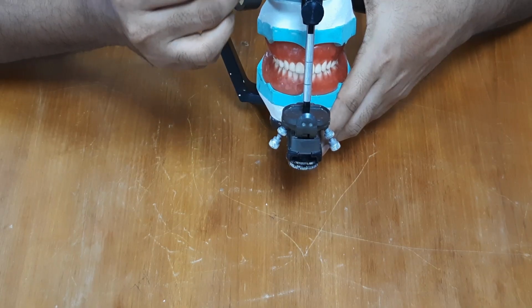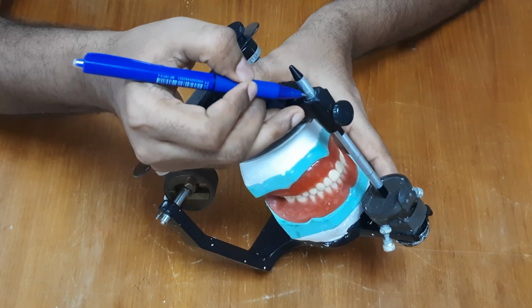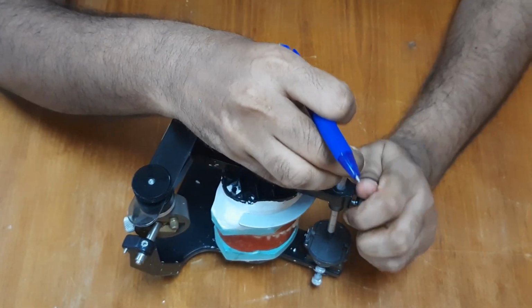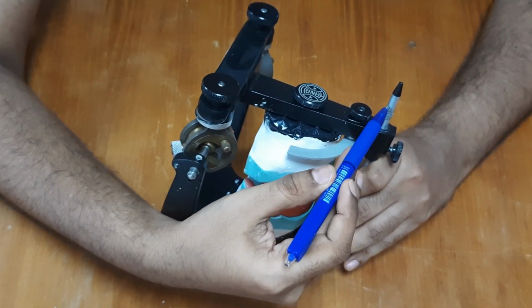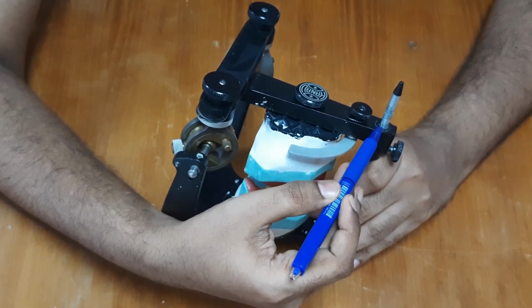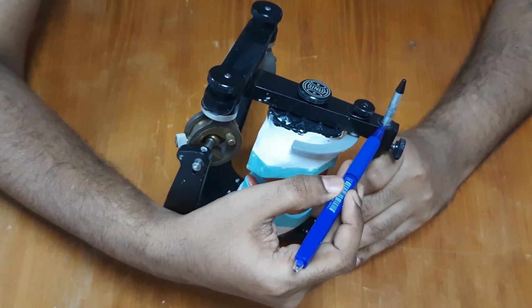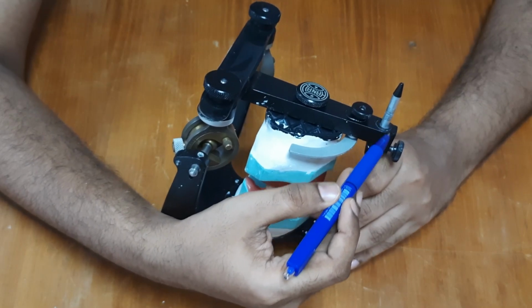There is a set of closely spaced markings on the upper end. These markings are thin markings and then a central thick marking. The central thick marking is usually used for setting the incisal pin when the vertical relation or vertical dimension at occlusion is being changed, when we are opening or closing the bite. It is useful for opening and closing the bite in the articulator.